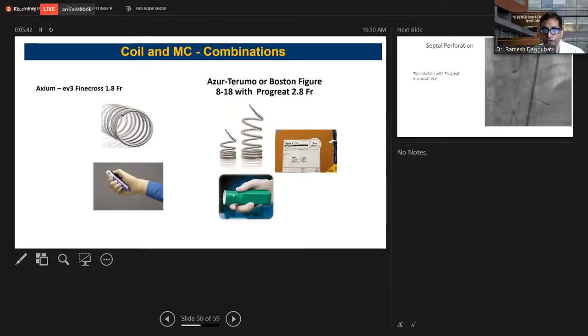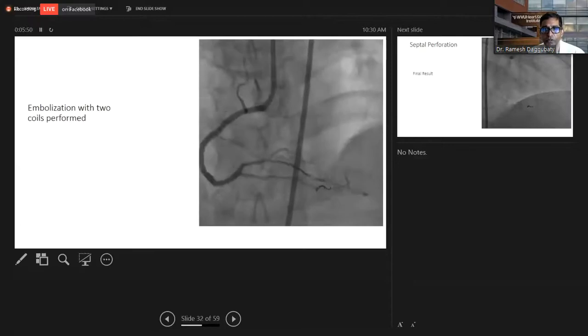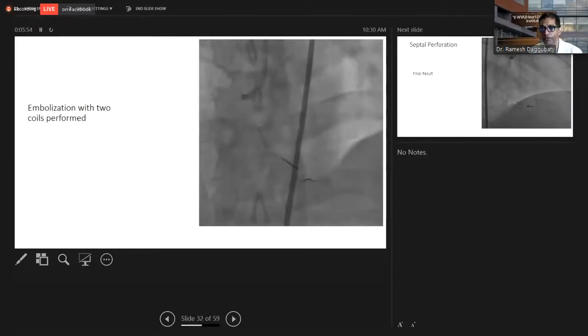Here you can use whatever you want, Azur or Progreat, and we used a Progreat catheter with tip injection and coiled it, and it was good. Sometimes you have to coil both from the antegrade and retrograde sides as well.